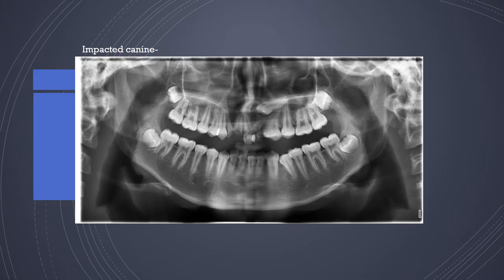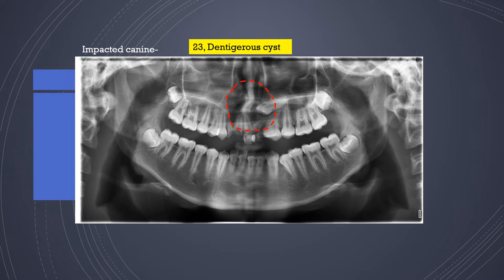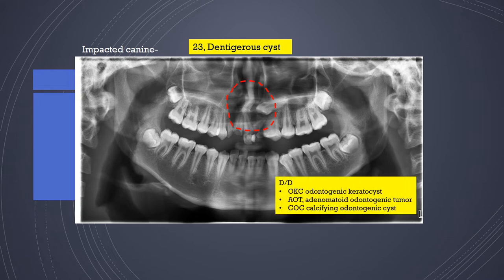Looking at an impacted canine, what is interesting in this radiograph is the considerable displacement of the maxillary anterior teeth, and you will notice a large radiolucency — most likely a dentigerous cyst associated with an impacted tooth. The radiographic differential diagnosis would include odontogenic keratocyst, adenomatoid odontogenic tumor, or calcifying odontogenic cyst based on location and likelihood.